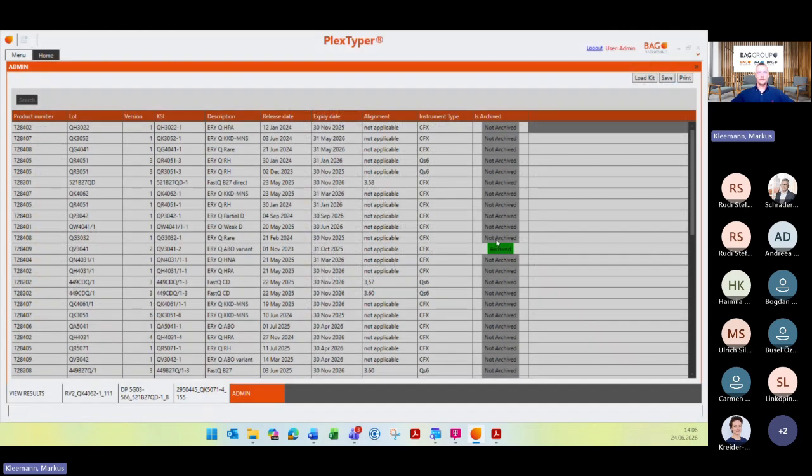Then you also may know from the basic webinar that you cannot delete the kit files and also not data from PlexTyper. It's only possible to archive them. So by clicking here on this not archive, it switches to this green one here, and then it will not be anymore at your plate setup. And you just will see your unarchived kit files. So whenever you do not need this kit file anymore, or the expiry date is over the time, then you can archive them, and then it's not on your test setup anymore. You also have the possibility to filter these files with this text search function here, or you can filter here, for example, after release date, after the instrument type, or the kit description.